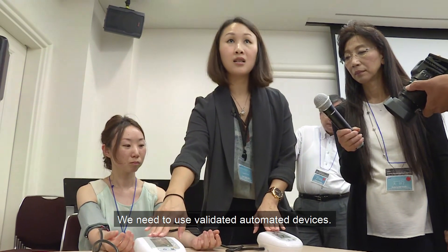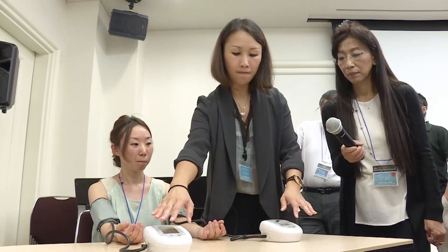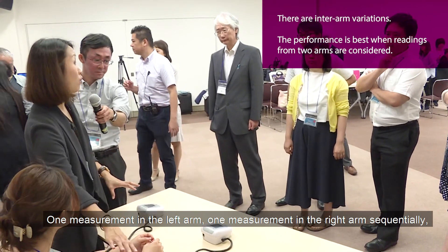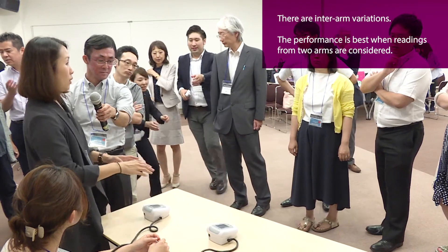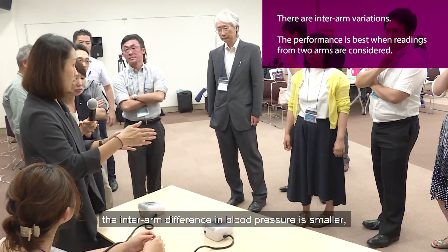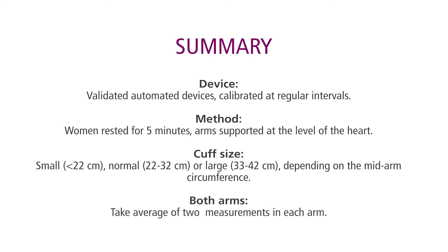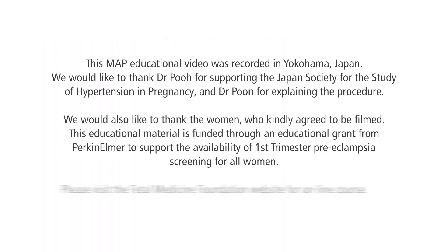We need to use validated automated devices — when I say validated, it means it's validated for use in pregnancy and preeclampsia. One measurement in the left arm, one measurement in the right arm sequentially using one machine means the difference between left and right is bigger, whereas if you do blood pressure simultaneously in both arms, the inter-arm difference is smaller. So it's a matter of timing.